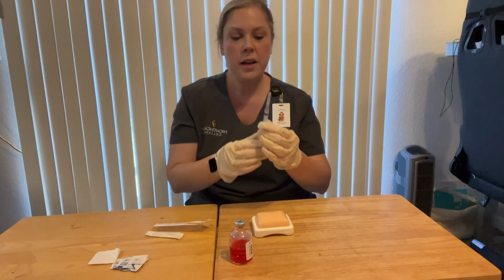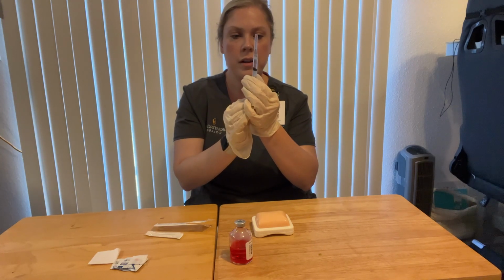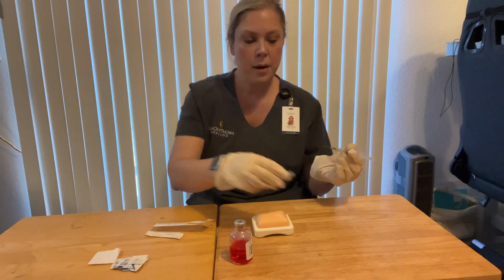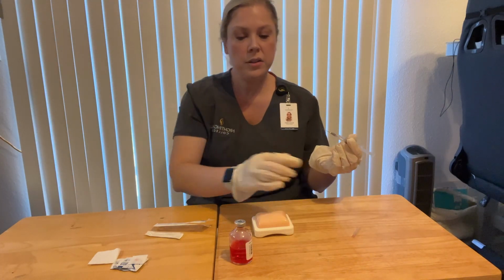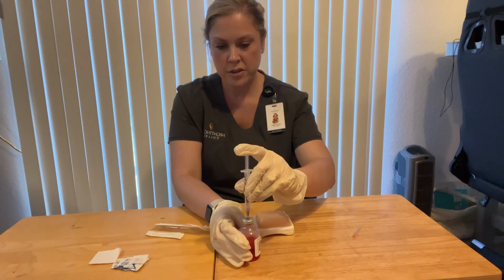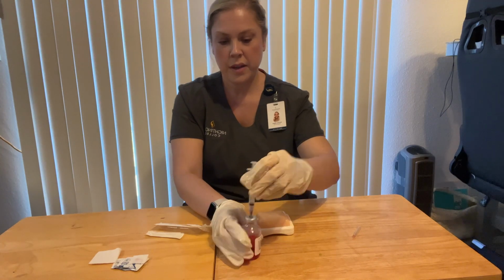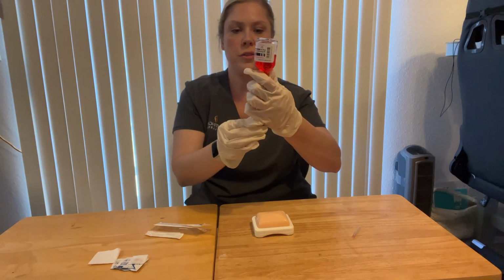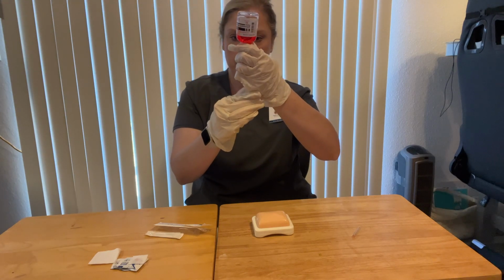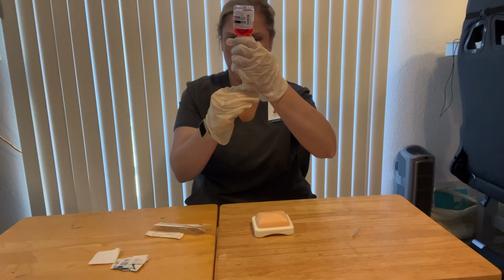With the cap still on, I'd want to withdraw 1.5 milliliters of air. I'd want to safely uncap the needle, go ahead and insert the air into the medication vial. Okay, then I'd want to withdraw that 1.5 milliliters of my medication, just morphine.